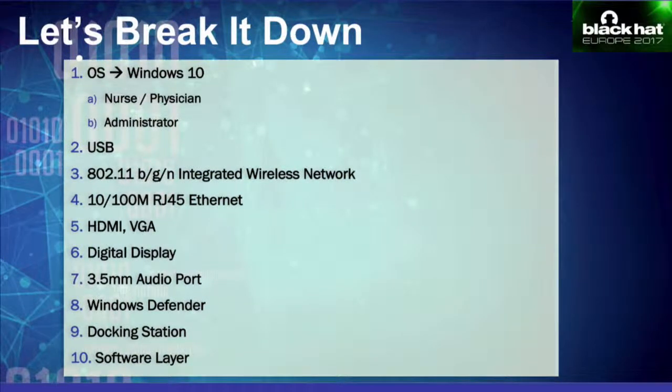Right, so it came with Windows 10 installed. There were two default accounts that we saw. One was a nurse/physician account, to be used by medical practitioners, and then there was an administrator account, which basically allowed manufacturers to remote into the device to perform remote operations.